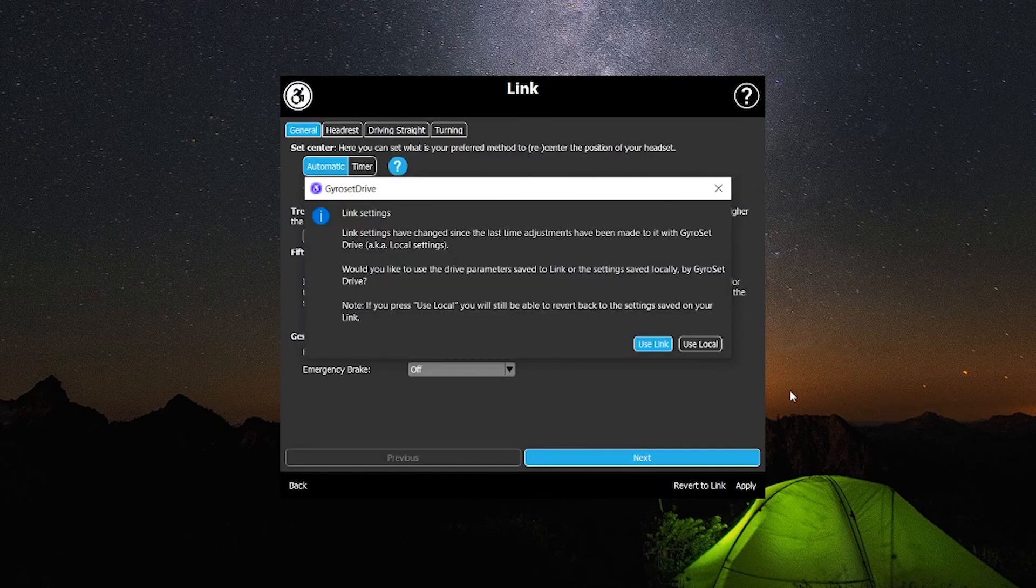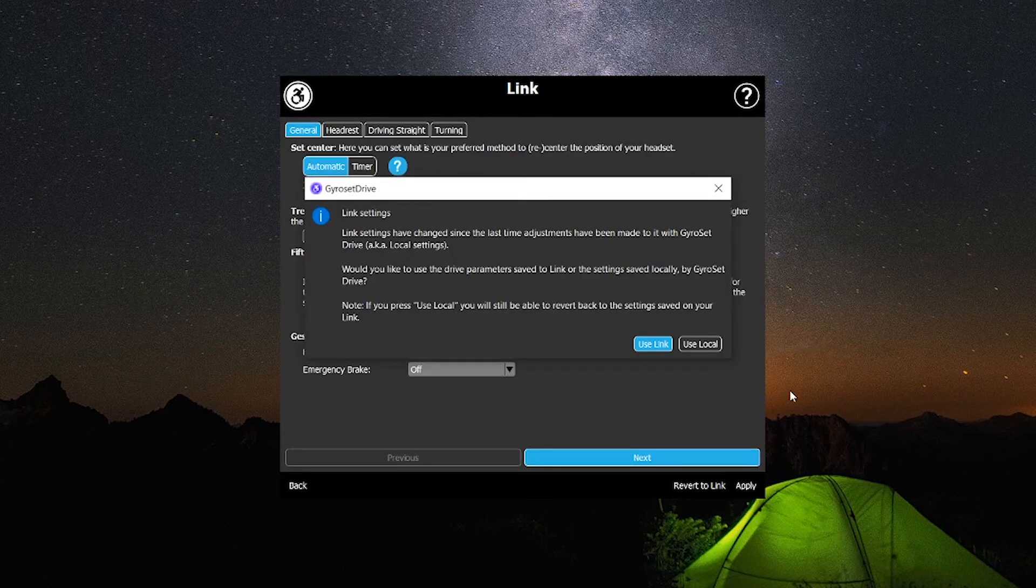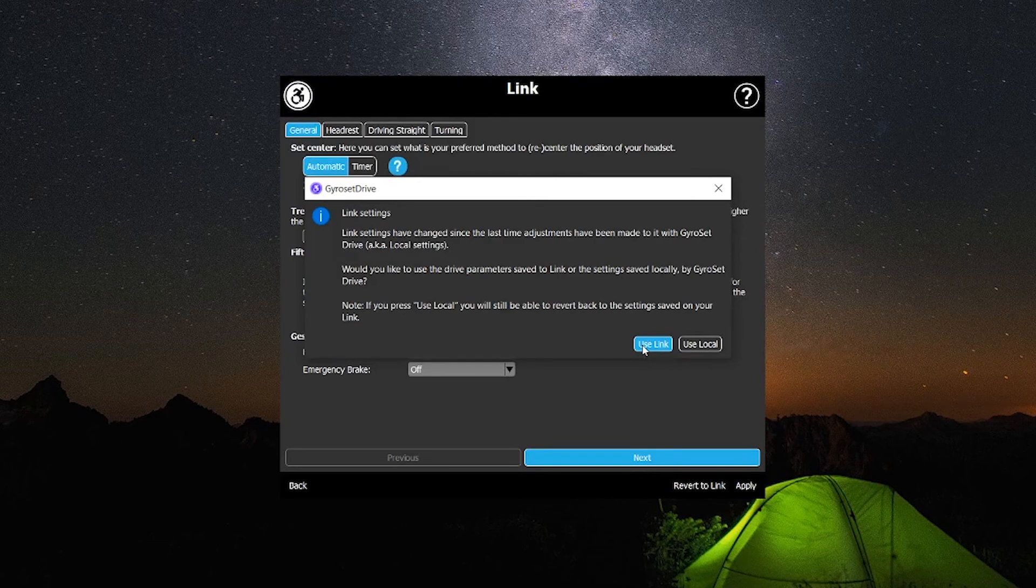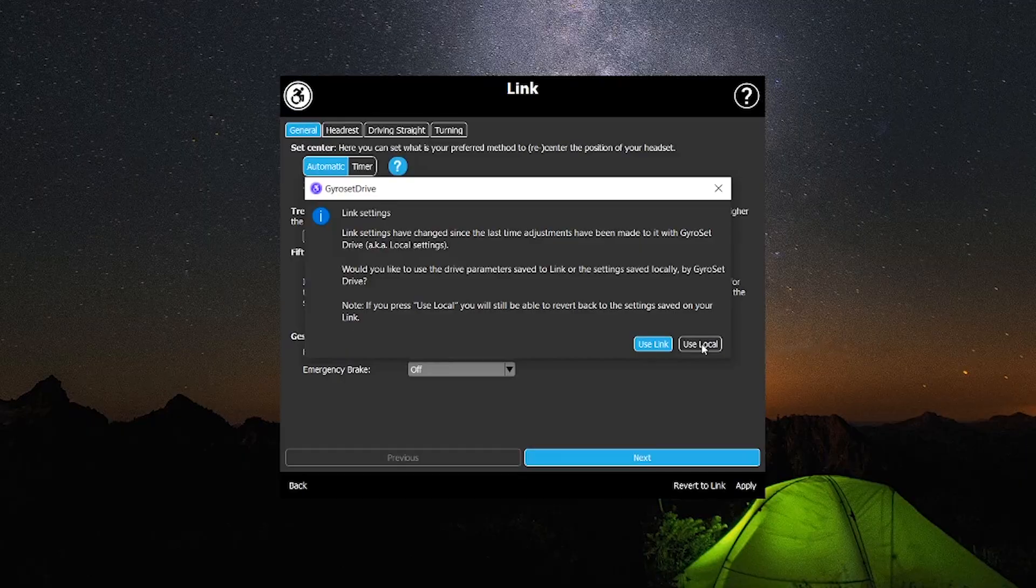If you have used the software to customize a different link before this one then a window will pop up asking you to choose between the local settings or the link settings. The reason for this is the last settings stored on Gyroset Drive are different to the ones on your link.